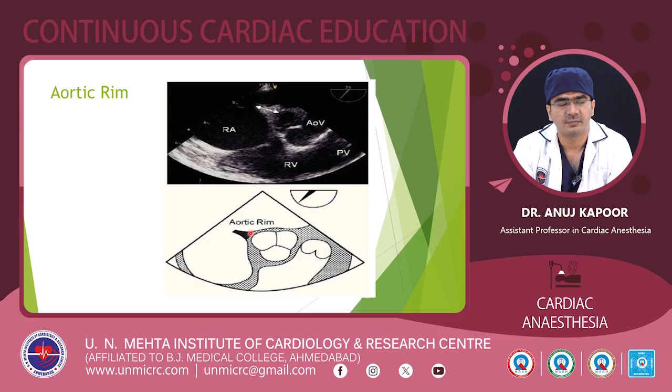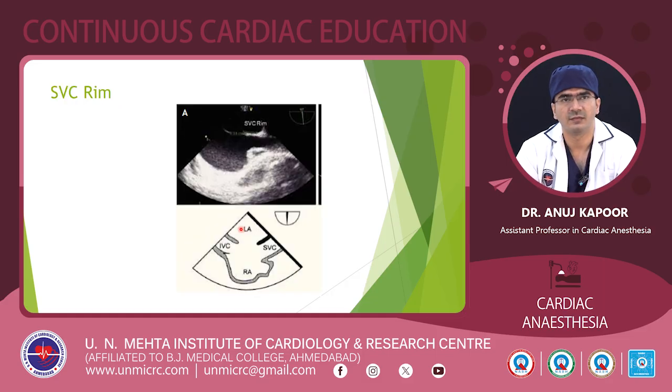If it is small, it makes the procedure challenging, but it does not contraindicate the procedure. If we have a rim of at least 3 mm, we can still progress or attempt a device closure. Now going forwards, we will look at the SVC rim. The SVC rim can be seen in a mid-esophageal bicaval view or modified bicaval view.